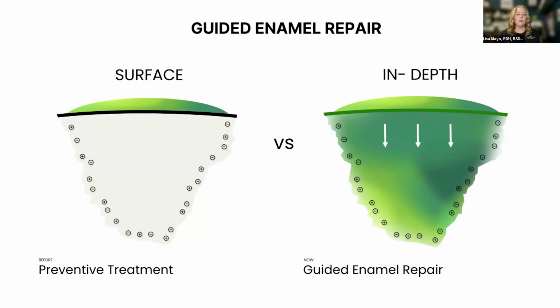You've got to use these words, the two buzzwords I use, and I use my hands. I tell my patients, hey, you've got early carious lesions. Here's the spots on the AI that we found today. But lucky you, these lesions are not through the enamel yet. So we can actually treat, there's the word, treat the carious lesion with this new procedure called guided enamel repair.